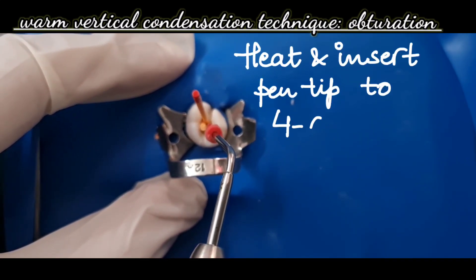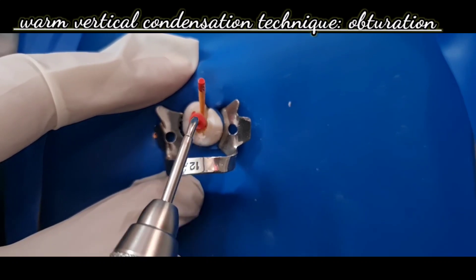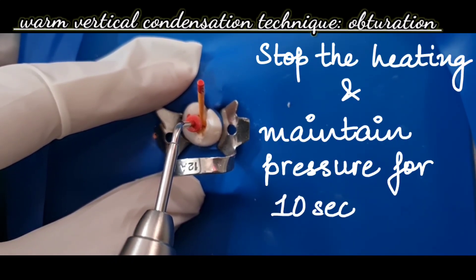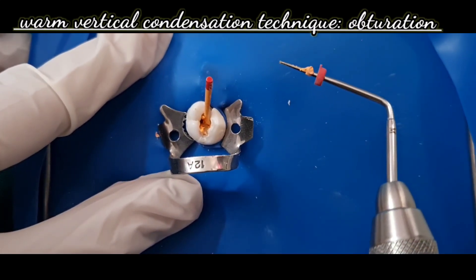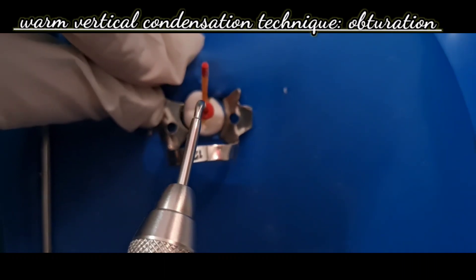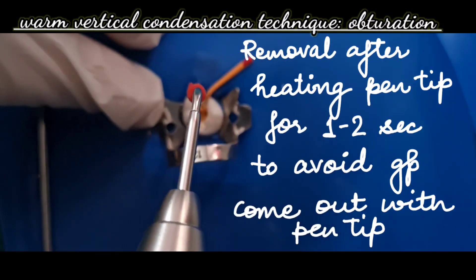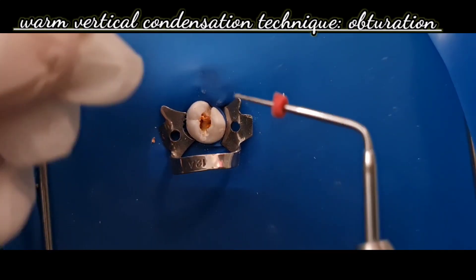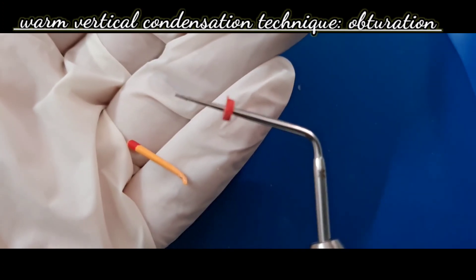The tip reaches working temperature in only 2 seconds. Heat it and insert the tip to 4 to 6 mm short of the working length. Hold the power button, then use the heating button — one or both heating buttons can be used. Stop the heating button and maintain pressure for 10 seconds to perform compaction. High temperature mode is recommended for this step. Heat the pen tip for 1 to 2 seconds before removal to avoid gutta-percha coming out with the tip. As you can see, the gutta-percha can be cut using the pen tip itself, with excess gutta-percha removed, and the pen tip cleaned after use.